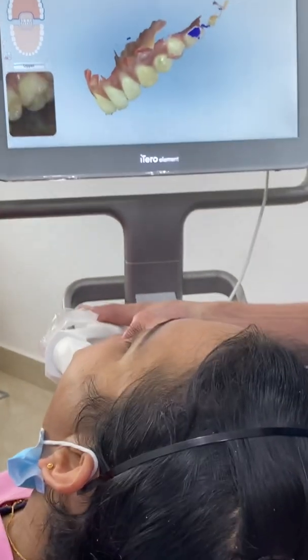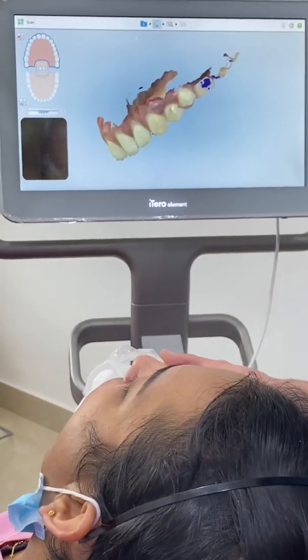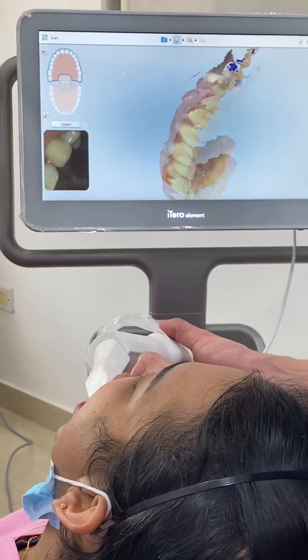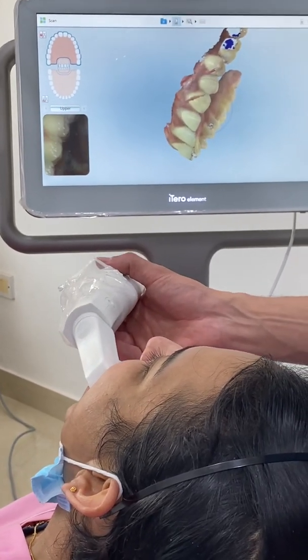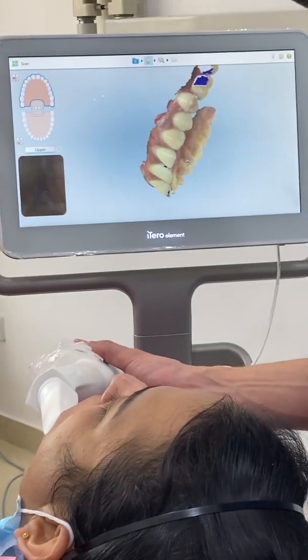If we had gloves on and we moved the cheeks, will it interfere with the scan? No, it will be deleted automatically by the AI. Saliva, your finger, her tongue, all that. Noise reduction.